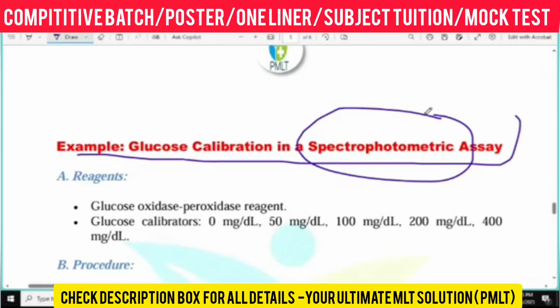Okay. So if I ask you one more question about doing the glucose test, while we are taking the blood, the gray vial. Can anyone say, besides the sodium fluoride, is another substance also used here? Which substance is there? Sodium oxalate. Very good.